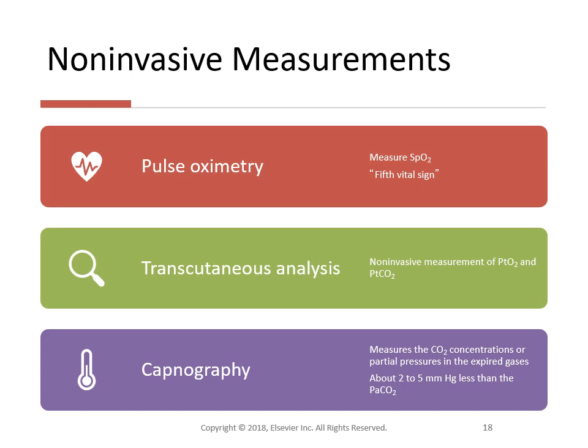Pulse oximetry has dramatically reduced the need for arterial blood gas sampling. However, it should never be substituted for blood sample analysis when the clinical situation demands a complete assessment of oxygenation. In addition, because pulse oximeters only provide oxygenation data, abnormalities in ventilation or acid-base balance can go undetected.